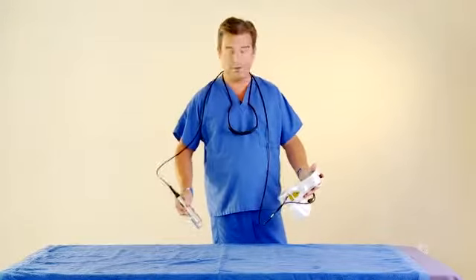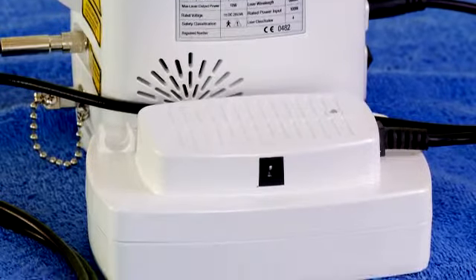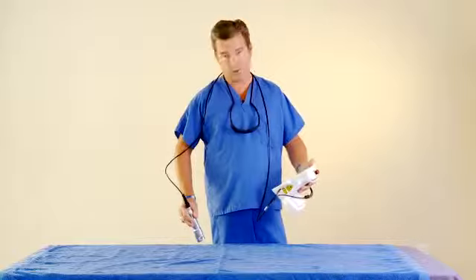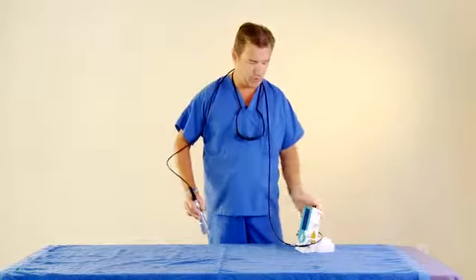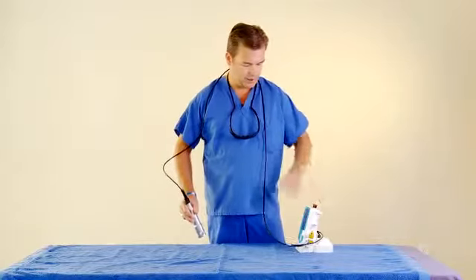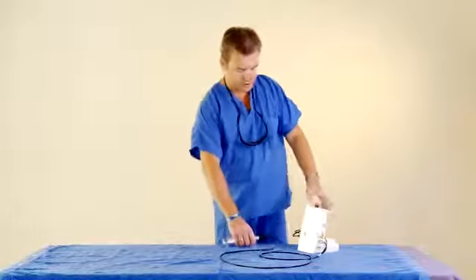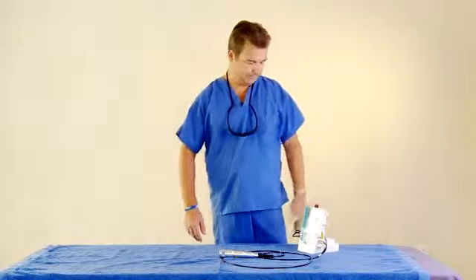The battery will run for approximately 2 to 3 treatments, or about 45 minutes to an hour of battery time before you need to recharge it, and that is running at full 10 watts. So depending on what you're treating, your battery can last anywhere from as short as 50 minutes to as long as 3 hours.